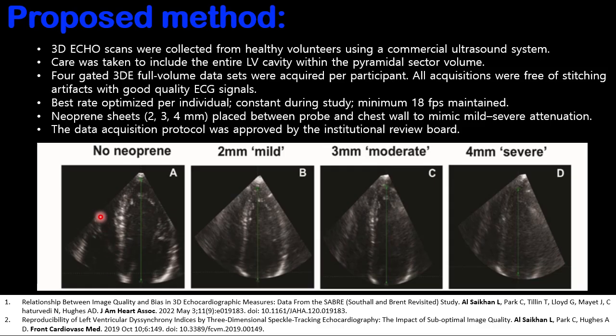In order to evaluate our method, we utilize this dataset, which is composed of several 3D echo scans that were collected from healthy volunteers using a commercial ultrasound system.